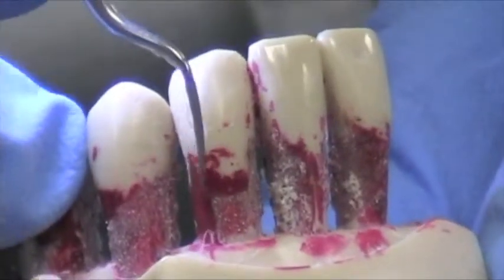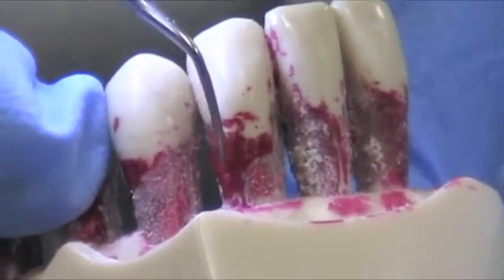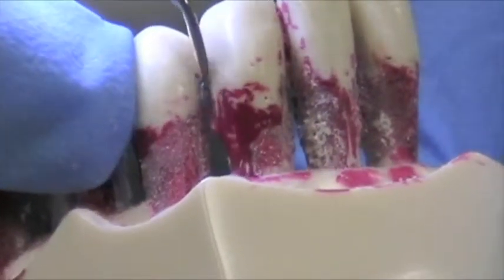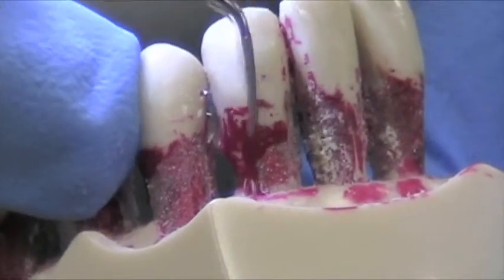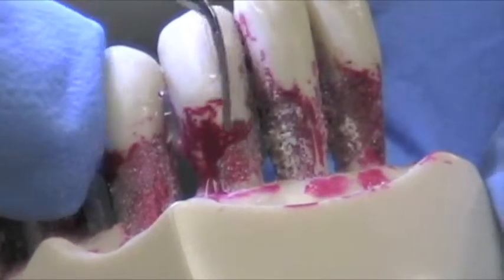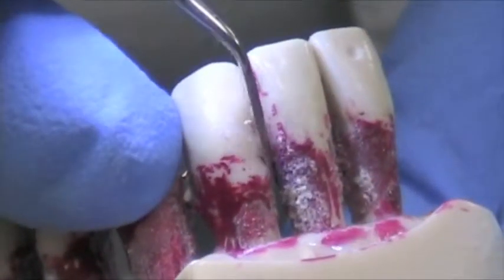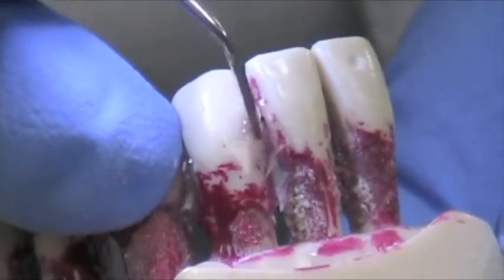These are diamond coated tips, and you really do have to have a very, very light touch. There are times when I use this tip, especially when I'm posterior, where I actually turn the water almost off, so I can see a creamy or milky consistency coming off — and that's actually the cementum. We don't want to remove the cementum anymore like we were taught. We used to take away the cementum and root plane it all off, but now it's just for conservative root planing.